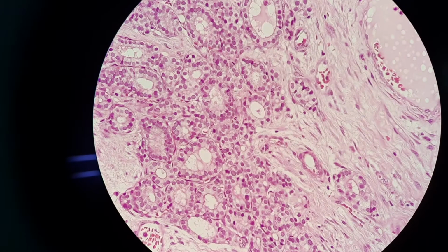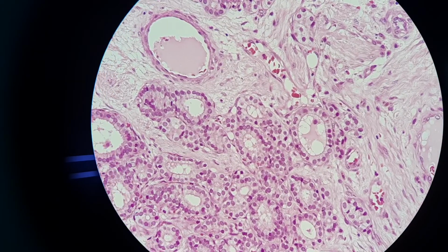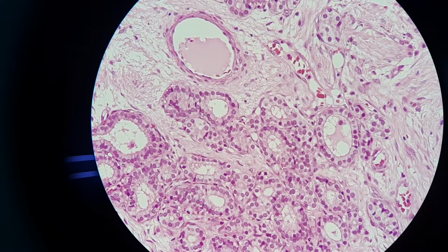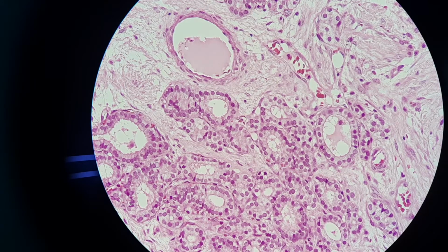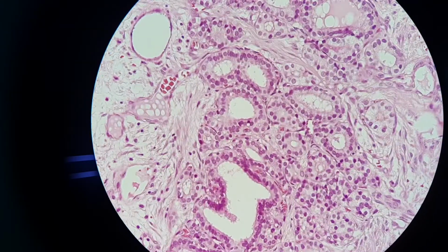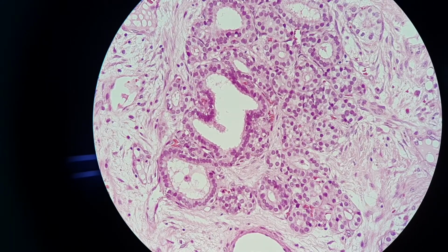Alright, so we're back to our structure here. You can see all of these somewhat look like thyroid follicles. It is very rare, not rare, it's actually impossible for thyroid follicles to be present in the femur marrow spaces here, unless it is a malignant tissue which has metastasized to this area. So based on this, we identify it as malignant thyroid tissue, metastatic to the femoral head.